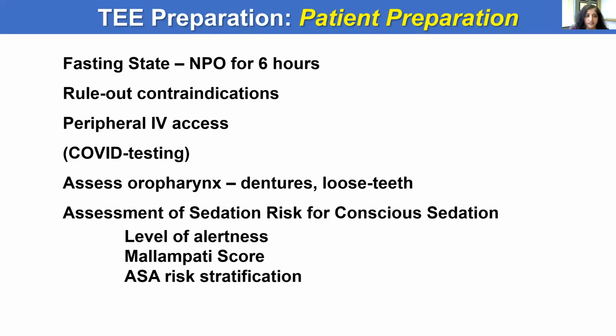Once we've decided to do a TEE on a patient, we next move to how do we prepare. The patient preparation involves a fasting state, typically NPO for 6 hours. You want to rule out all contraindications of TEE and resolve any relative contraindications. Peripheral IV access is required.